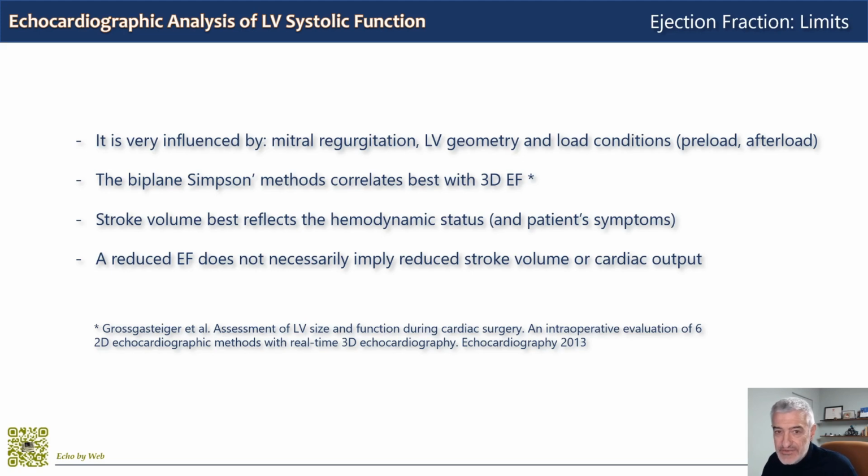In the case of ejection fraction, remember that it is influenced by preload and therefore, for example, by mitral regurgitation, which increases preload. And it is influenced a lot by afterload and therefore, for example, the blood pressure present at the moment that you do your examination, and for example by aortic stenosis. In this regard, remember the very close inverse relationship between afterload and ejection fraction, always.